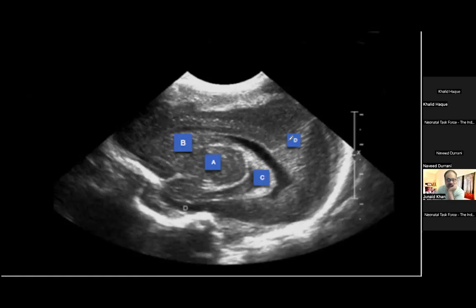Yeah. What is this, Naveed? D? Where? Here. Down. Oh, yeah. It's the RT. The D is this one. I know, but they wrote a D for what here. I'm not sure it is a D or it is an artifact. I'm not sure. Okay. I just noticed.